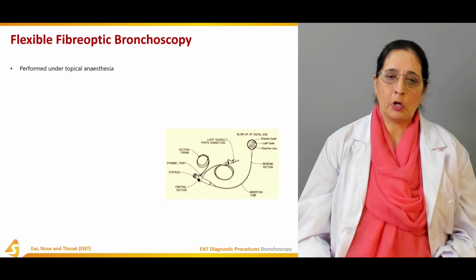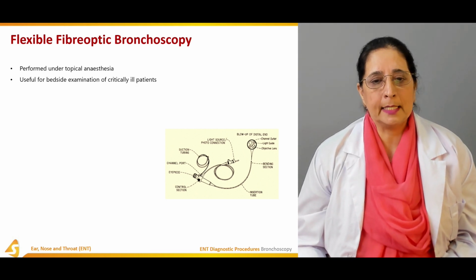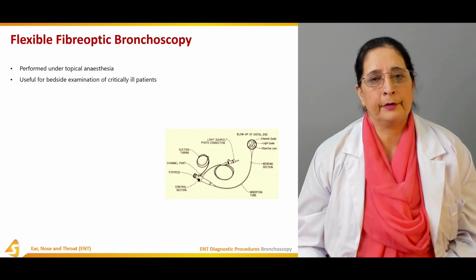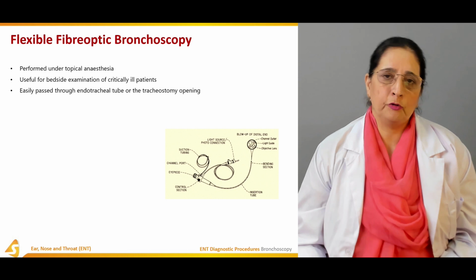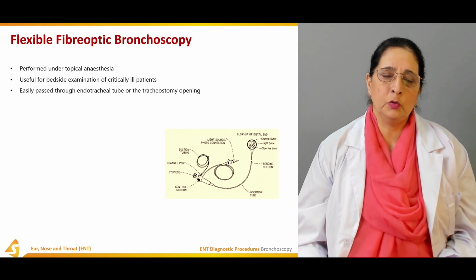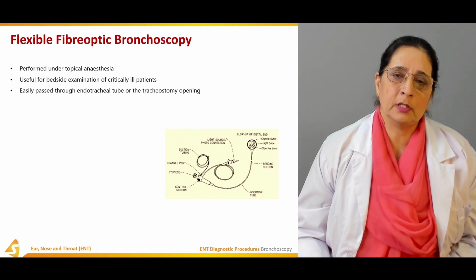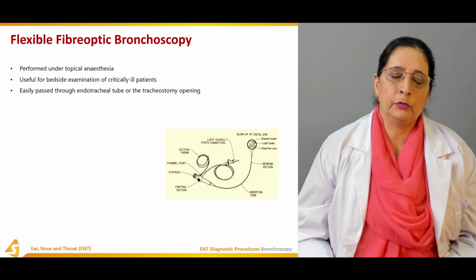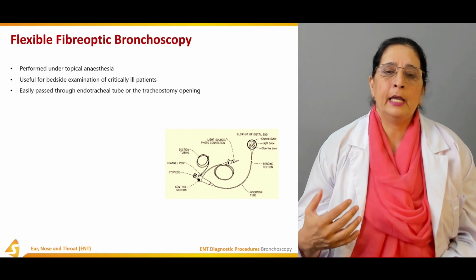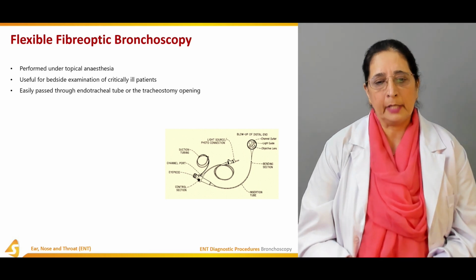Perform under topical anesthesia. Useful for bedside examination of critically ill patients. Easily passed through endotracheal tube or tracheostomy opening. If we need the tracheostomy opening for the breathing problems, it can even go through the opening, and the endotracheal tube, it can easily pass through that.